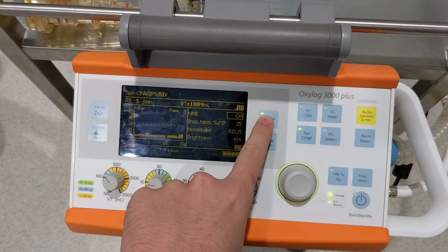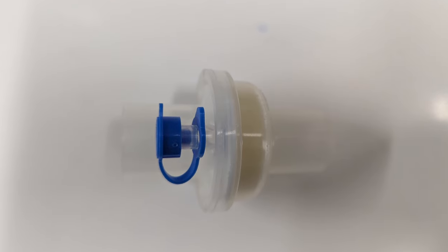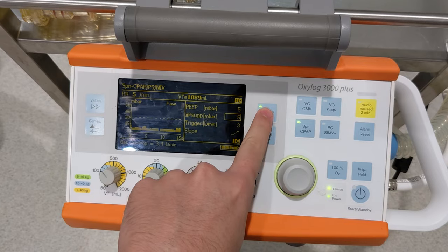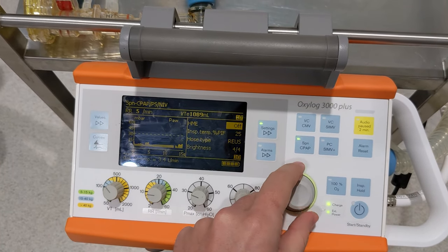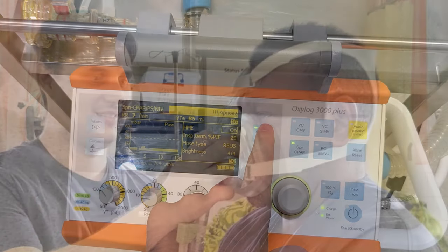The next setting that you need to look at is the HME setting. A HME is a heat and moisture exchanger, and if you're using one for your patient, then you need to turn this setting on, as it changes the pressures and volumes needed to ventilate the patient properly. To change this, we need to go to page 3 of 3 of the settings, then select the HME setting and change it to yes or no depending on what you're using. Don't forget to confirm by pressing the rotary knob down.